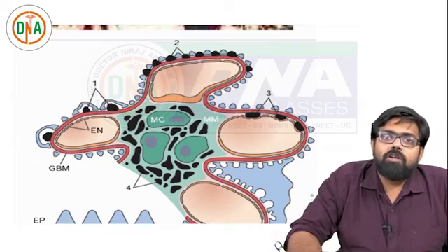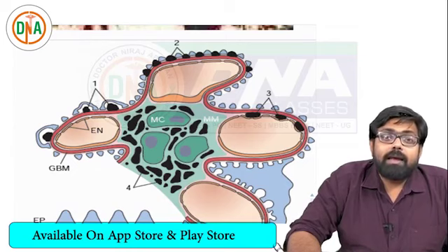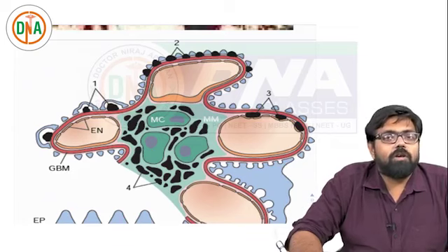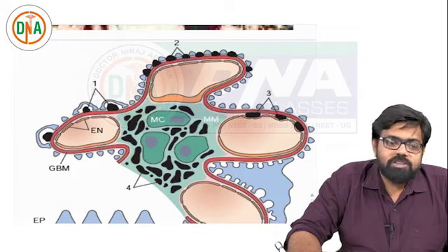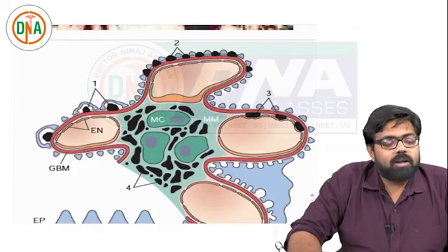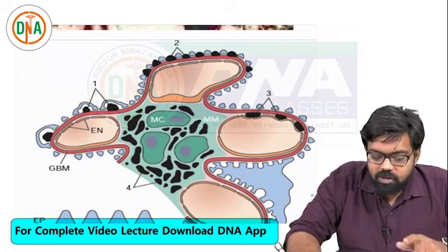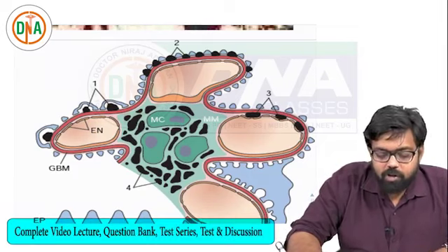And what we can make out on immunofluorescence, we discussed, is the exact pattern of the deposit, whether it is fine granular, coarse granular, or linear. You can also make out the composition of the deposit, whether it is IgG or IgM, whether any alternate pathway complement or classical pathway complement is there, or IgA is there. So these things can be made out on immunofluorescence. This mostly is to give you a rough idea of the different types of deposits in a normal image.